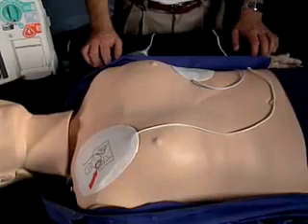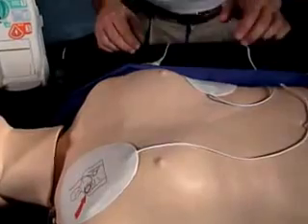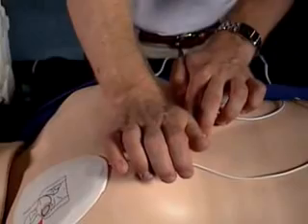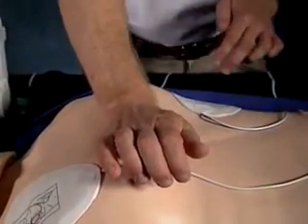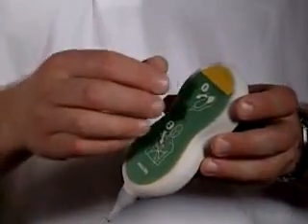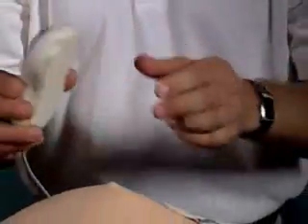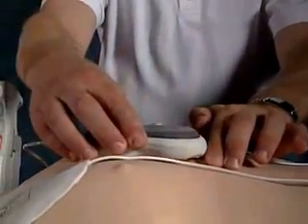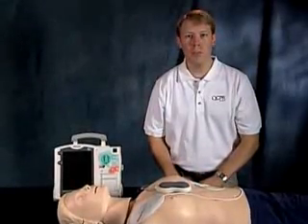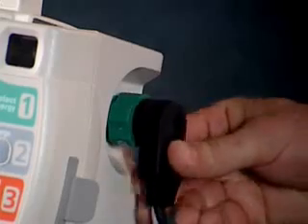The defibrillation pads are placed in the standard anterior positions. The compression sensor is placed in the same location that the heel of your hand would be for doing compressions during CPR. Prior to placing the compression sensor on the patient's chest, peel back this liner to expose the adhesive surface. This adhesive holds the sensor in the correct position. Then, both the defibrillation pads and the compression sensor are connected to the MRX at the therapy port.